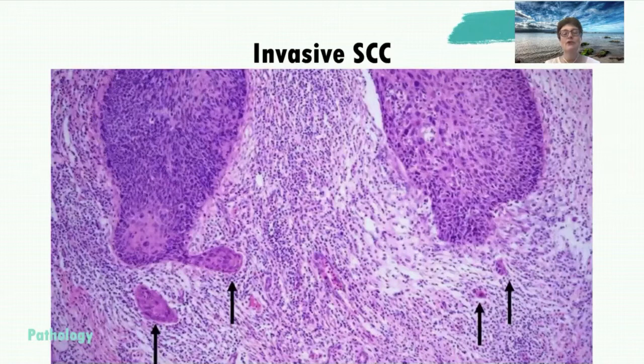Moving on from CIN, we can see here an invasive squamous cell carcinoma. What we have here is CIN3, which has migrated into glands, not yet invasive, but suddenly it breaks through the basement membrane, and we now have these areas of invasive squamous cell carcinoma. And if this isn't removed, it will progress.